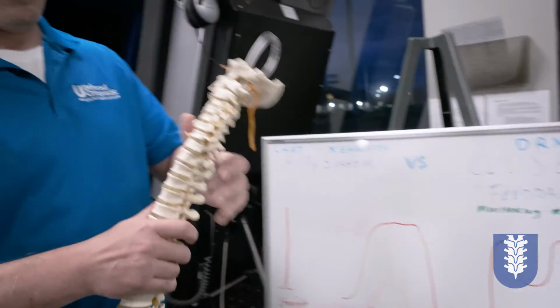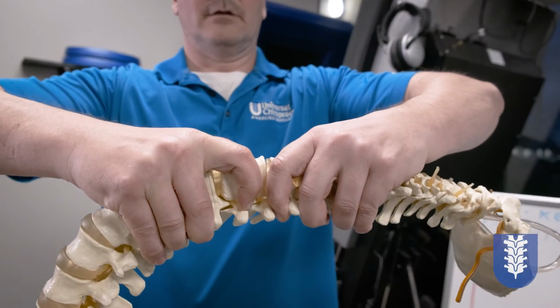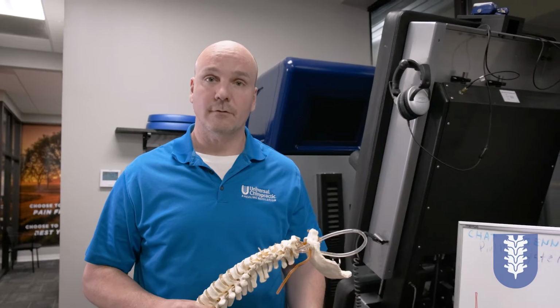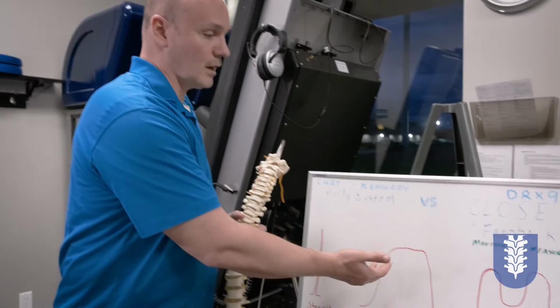So if you think about it, going back to the model of the spine, we have a traction, release, traction, release, and roughly you get about maybe a dozen of those over the course of a minute. So it's still very slow and controlled. That tells us the difference between an inversion table or traction versus decompression, when we talk about the different cycles.